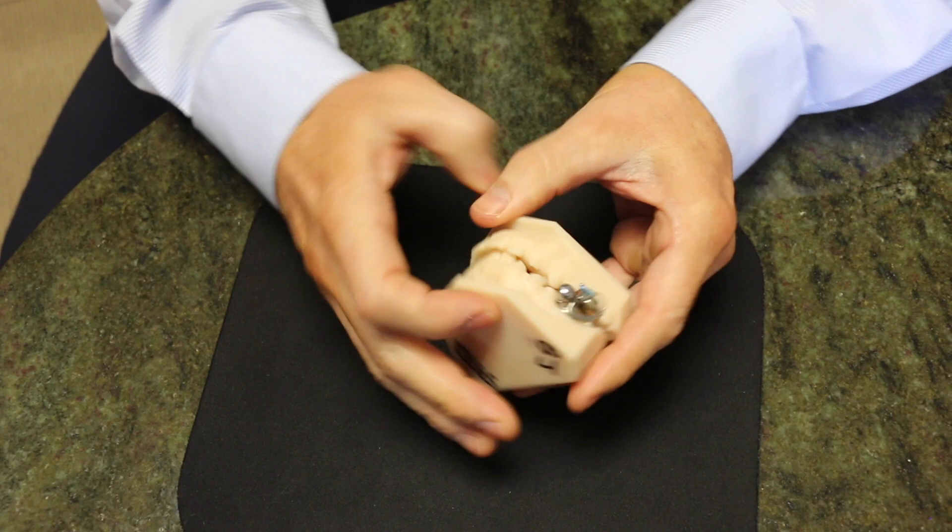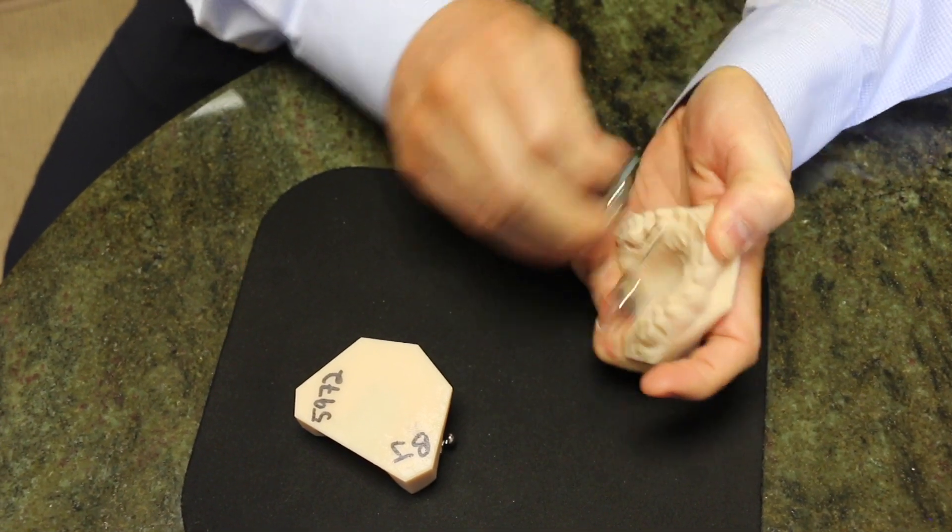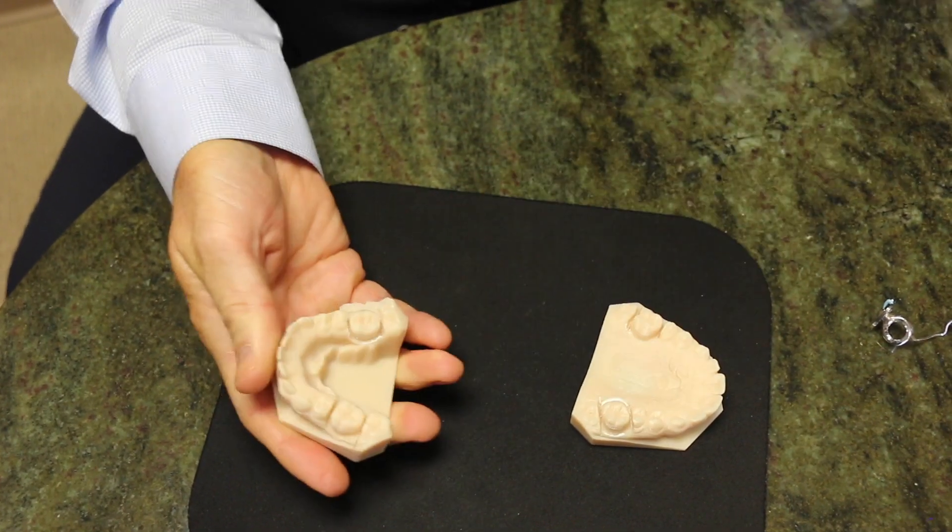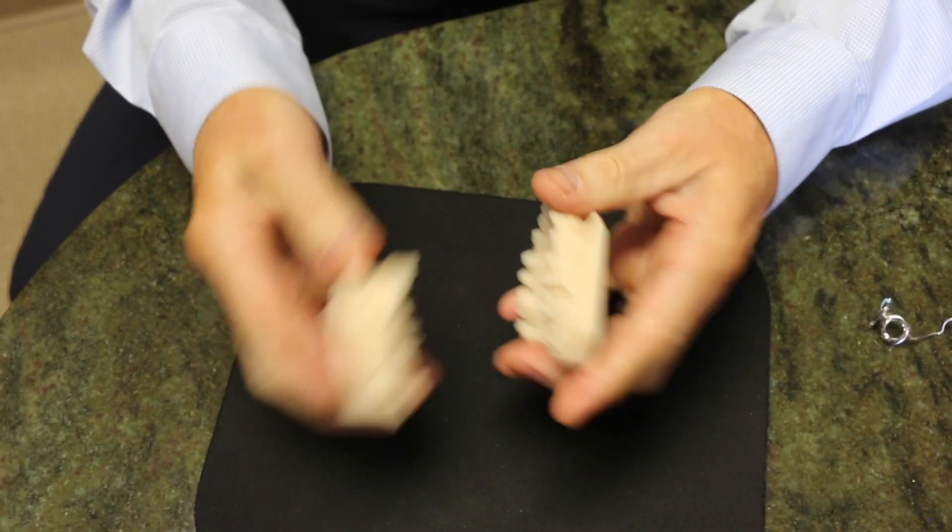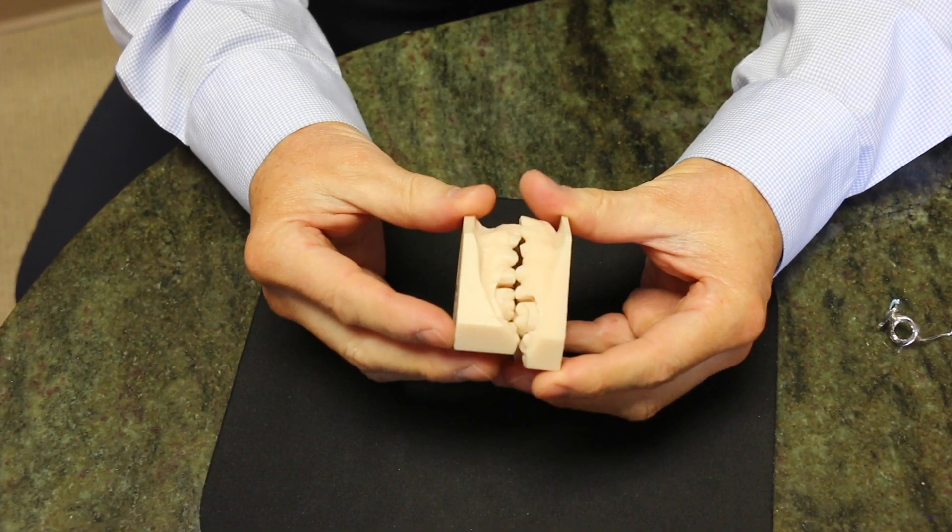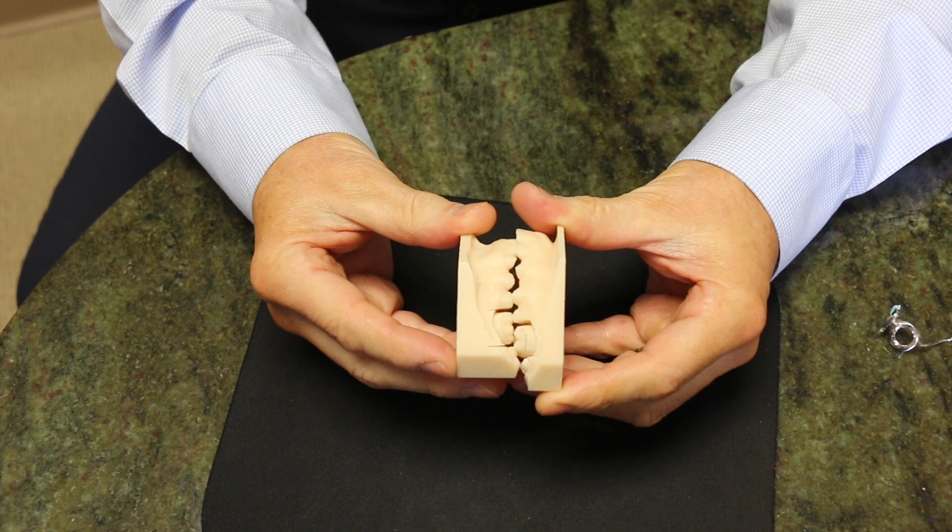After a year we remove the appliance like this and like this, and then we put braces on the rest of the teeth and finish up the straightening and fine-tuning of the bite. But their jaw has grown into that position and now this is their new bite.